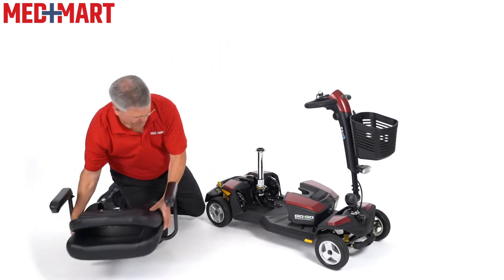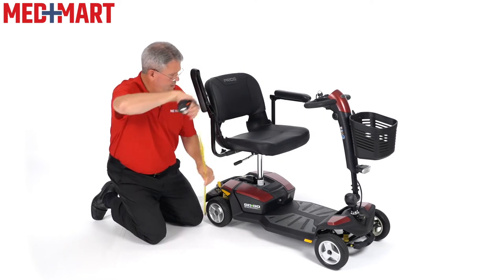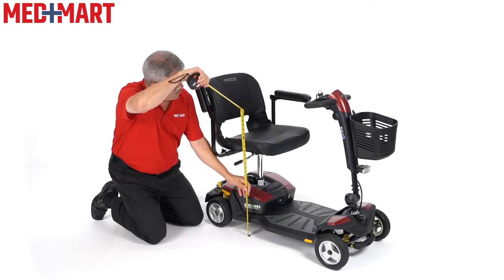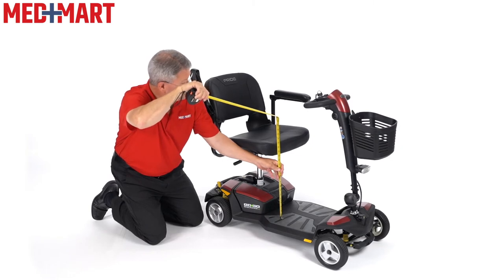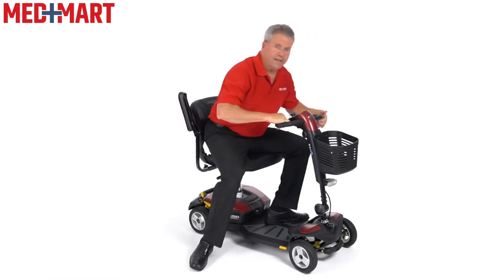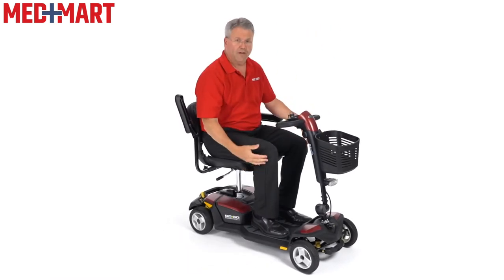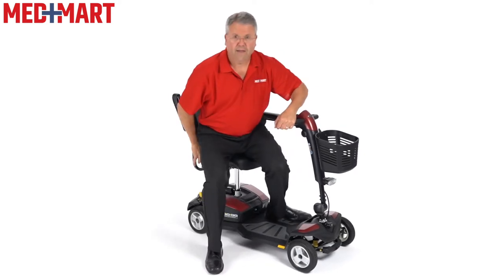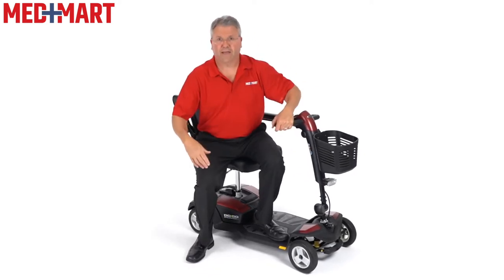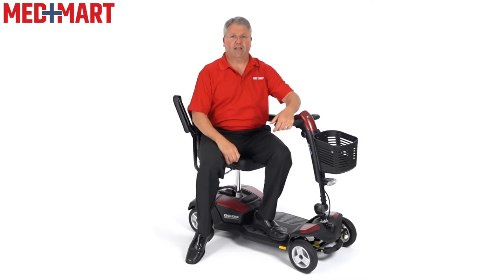We're going to check that right now. Now our seat to floor is about 23 and a half inches and the seat to the foot plate is about 17 and a half inches. So now when I sit down it gives myself a little more seat to floor height. It makes it a little bit easier to get up, or if someone needs that extra little bit of height, that gives you it by raising that seat up a little bit.